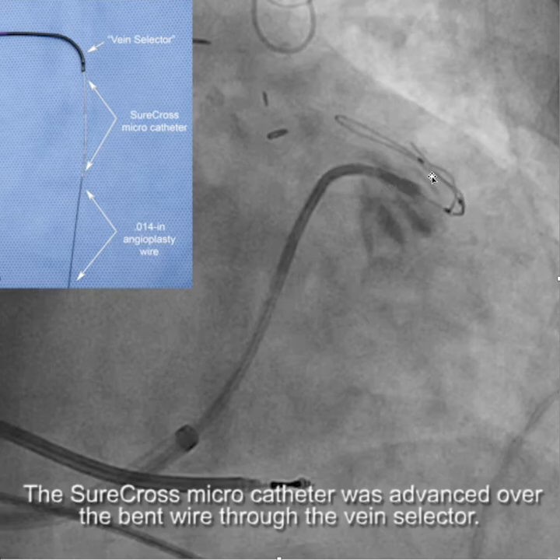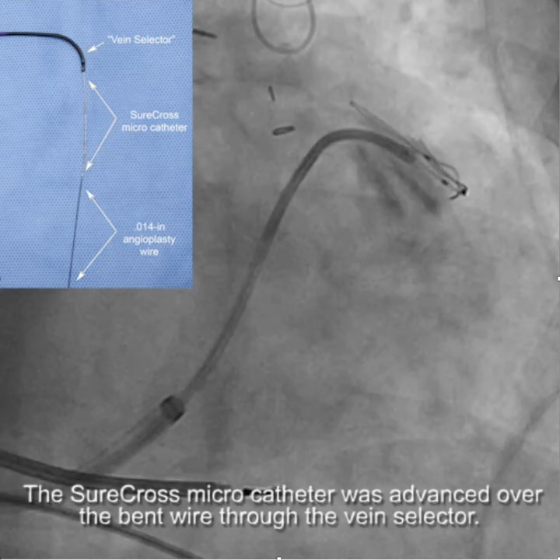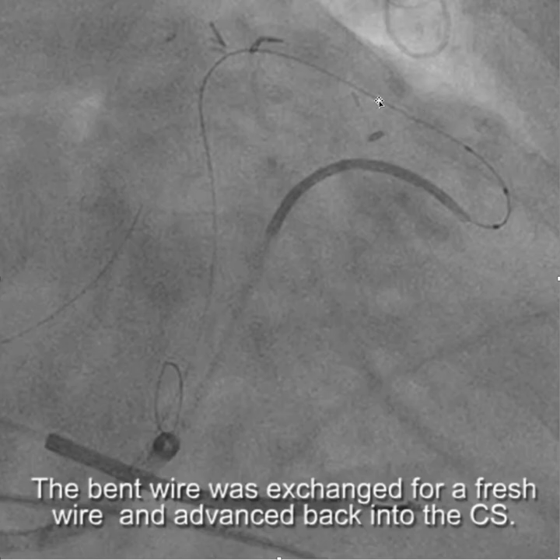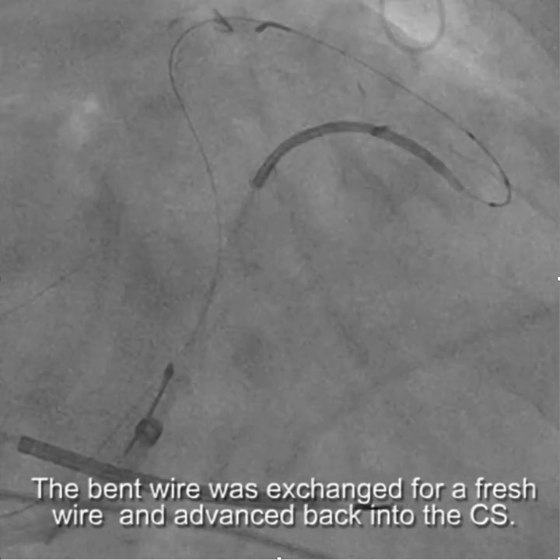I got the wire to here and couldn't get it to go any further, so we advanced the microcatheter over the wire as far as the wire had gone. Then by removing that wire and putting a fresh wire in, we were able to get it to go back through the collaterals, snare it, and then get the lead in.